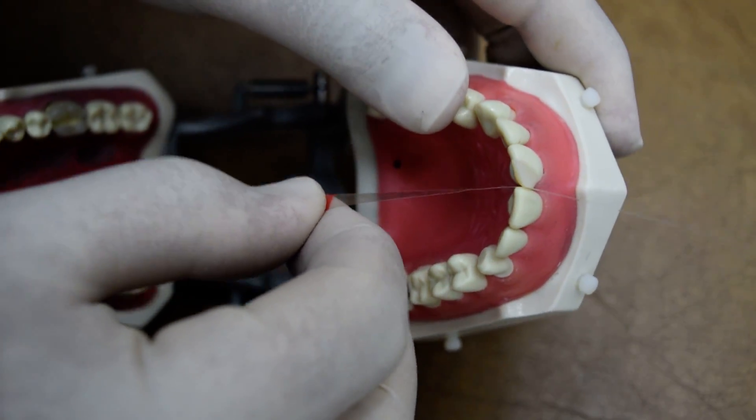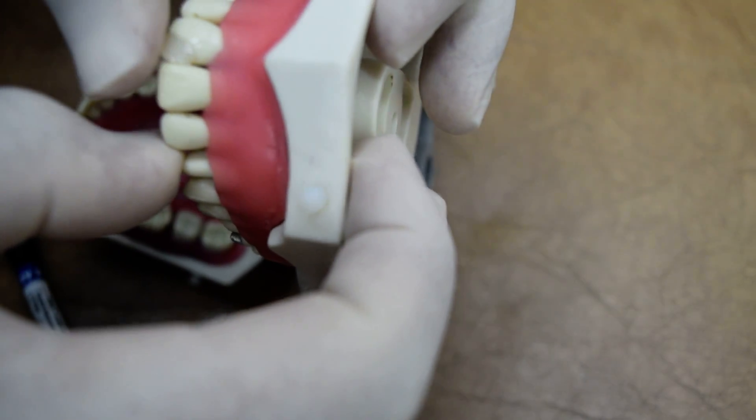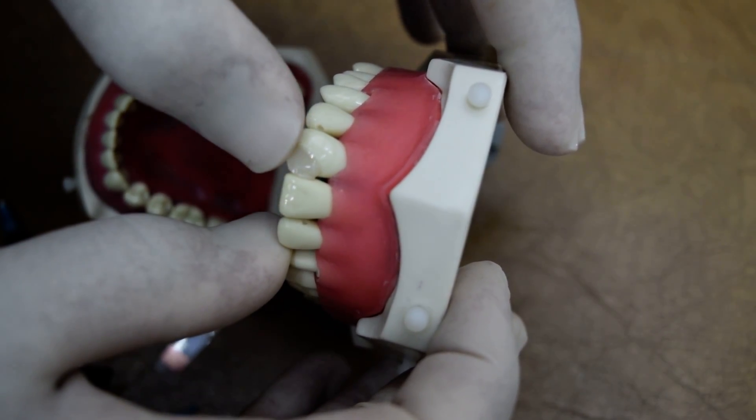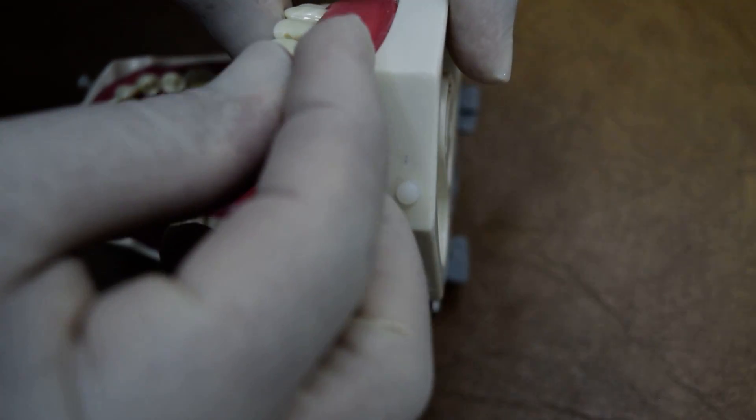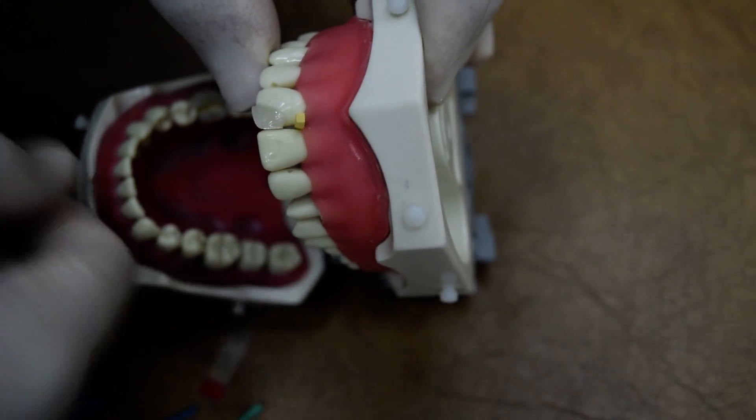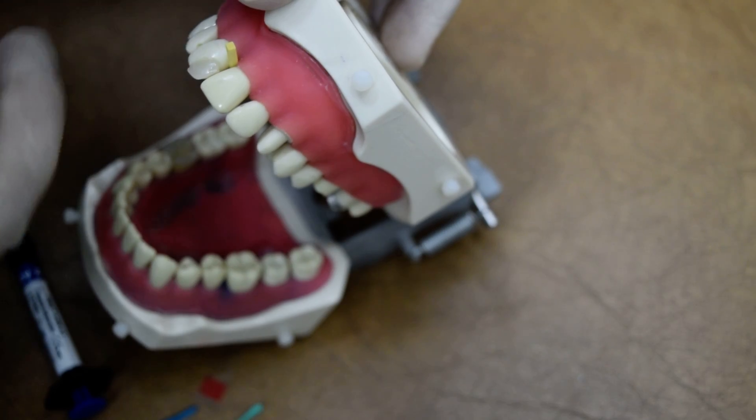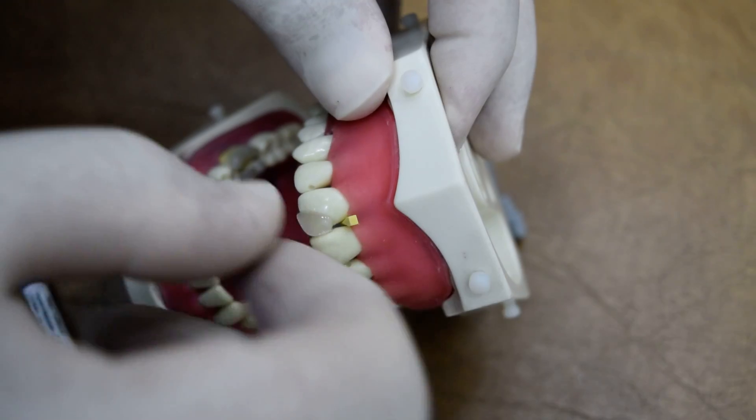Then you can see it's already built now labially and proximally. There is much excess here and also at the proximal part, but we can easily remove it by putting a wedge and then we will use the Soflex to remove this excess.